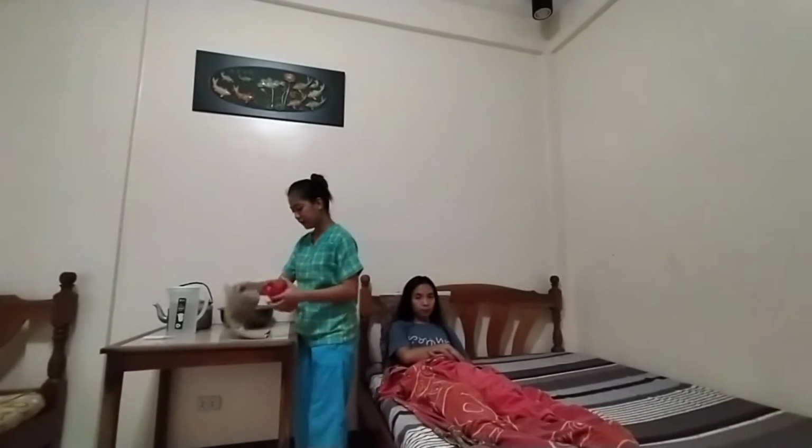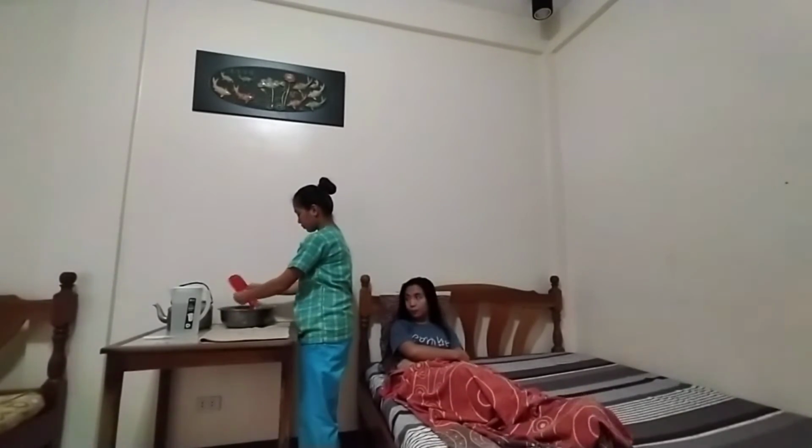So now, I'm going to clean the hot water bag with clean water. Open the hot water bag and use clean water. Check if there's leakage of hot water, up and down. Then remove the water, and fill the bag about 1/2 to 2/3 full with water at 55 to 60 degrees. Filling the bag only 1/2 to 2/3 full will prevent discomfort due to the weight of the water.